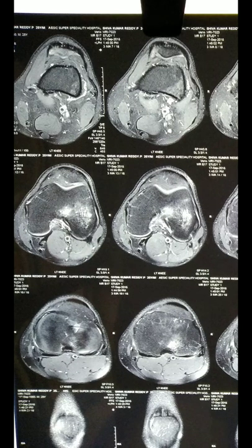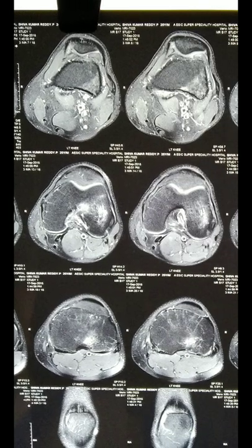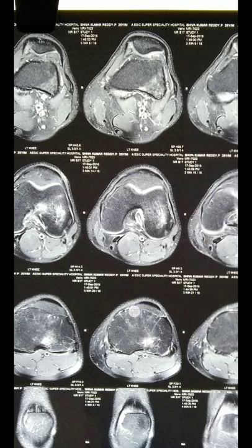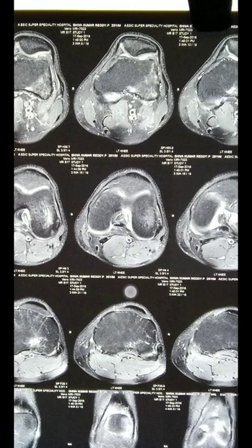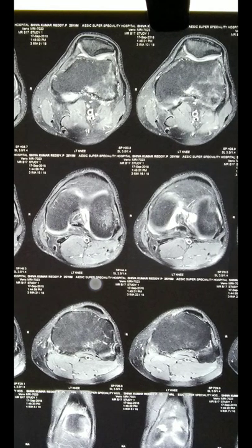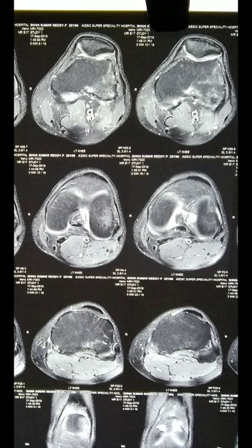We can also see the popliteal vessels in these axial cuts. We are also able to appreciate a gap medial to the lateral femoral condyle.